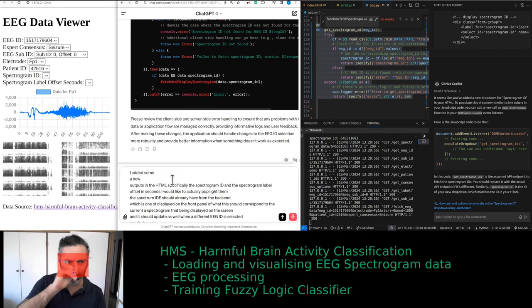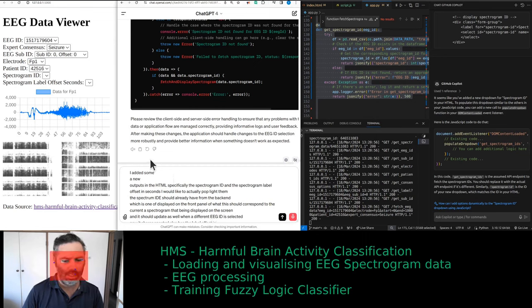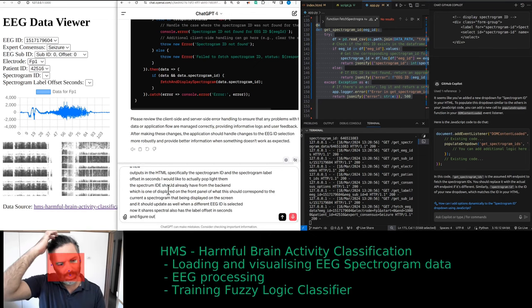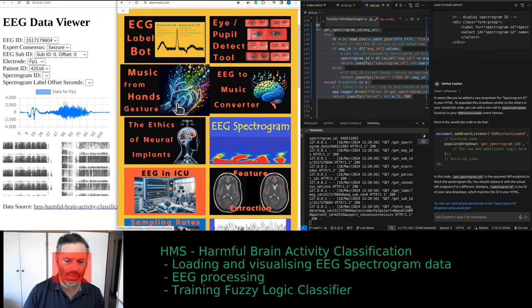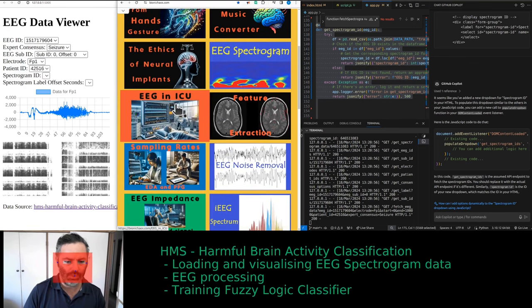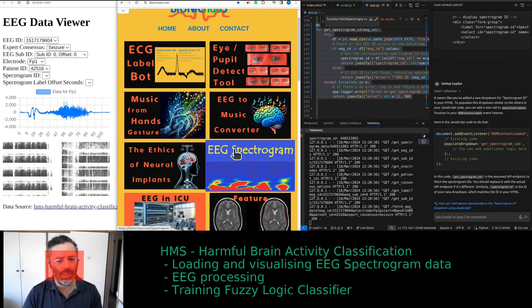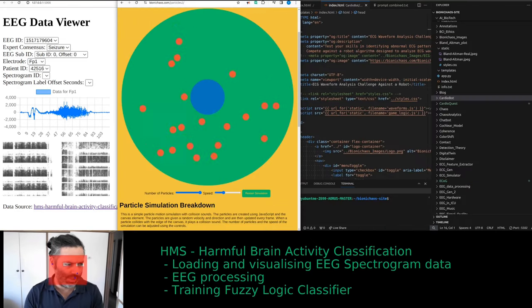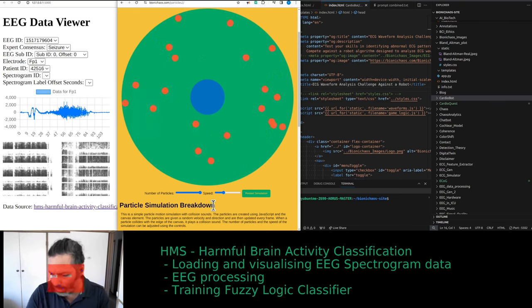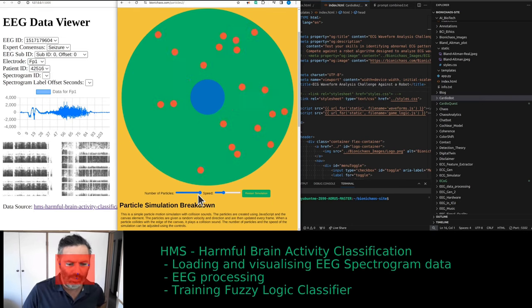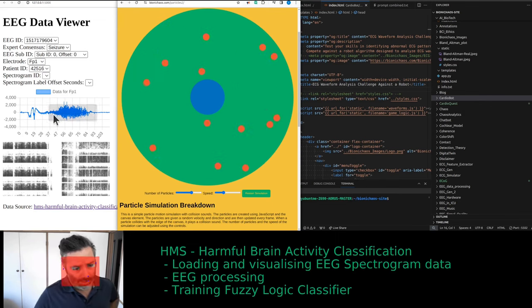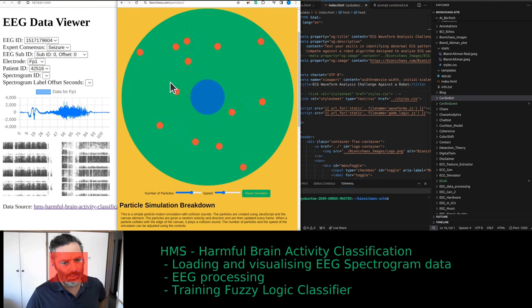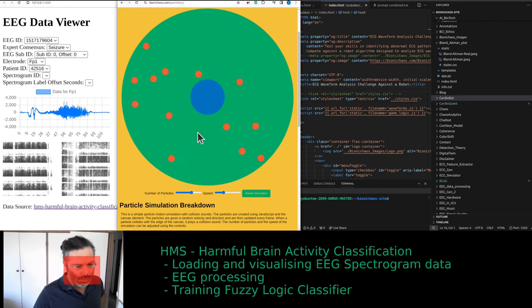Each spectrogram also has a label offset in seconds that we need to figure out how to display. Later, we would try turning this particle tool into a different way to review EEG waveforms. For example, with seizure data, the speed could be mapped to frequency. Each channel would have its own musical note, and the number of particles would be the number of channels — here we have 20 of them.